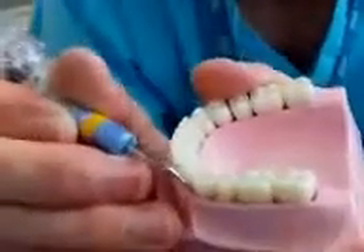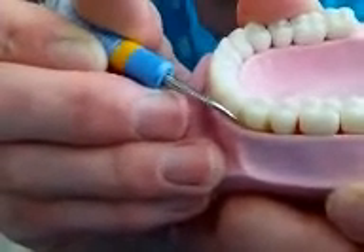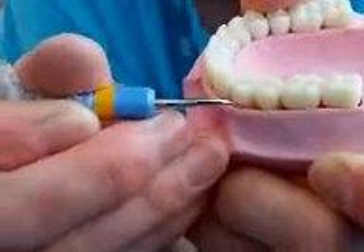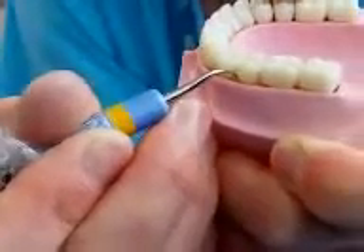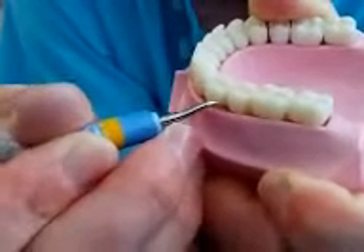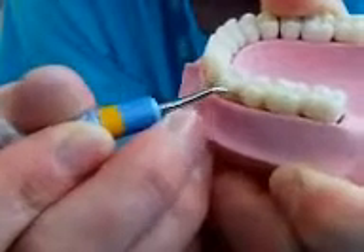Then you'll be coming from the front of the tooth, just easing your way around where there's calculus or where the pocketing is deep. Just ease your way around into the next interproximal space, and again just small movements on the tooth, trying to cover all of that tooth surface — that root surface — so that you remove the calculus.